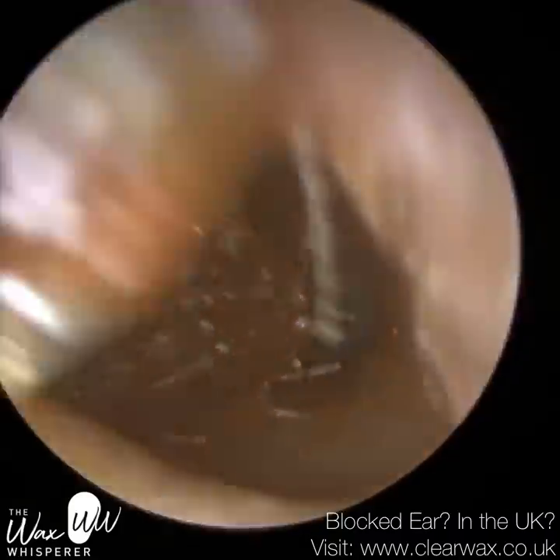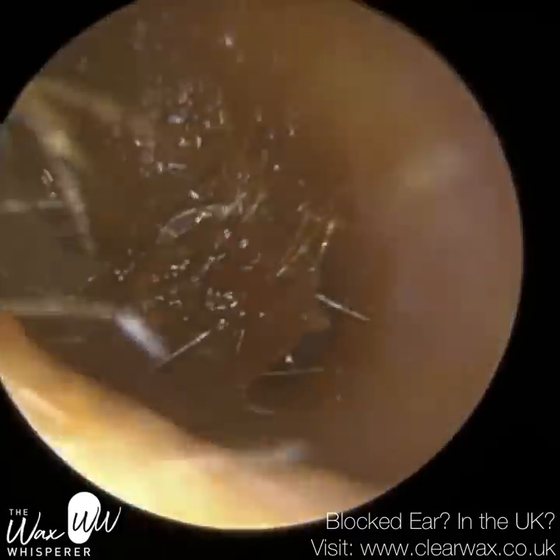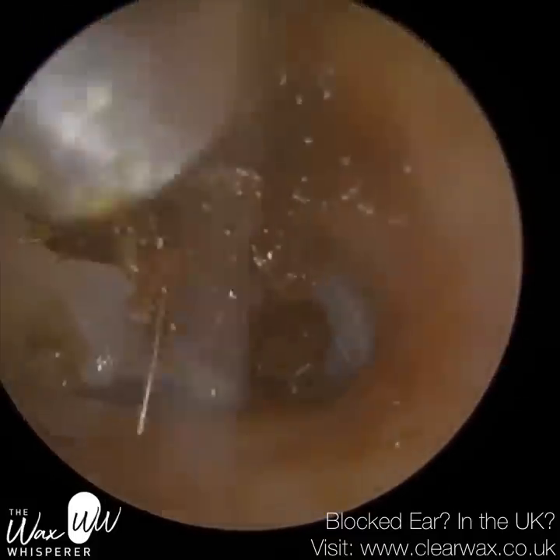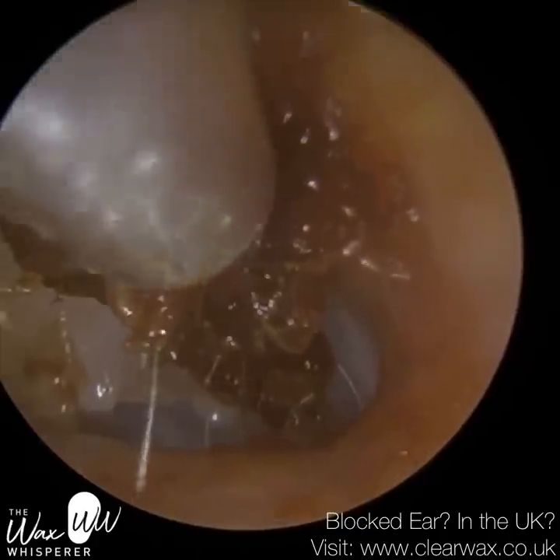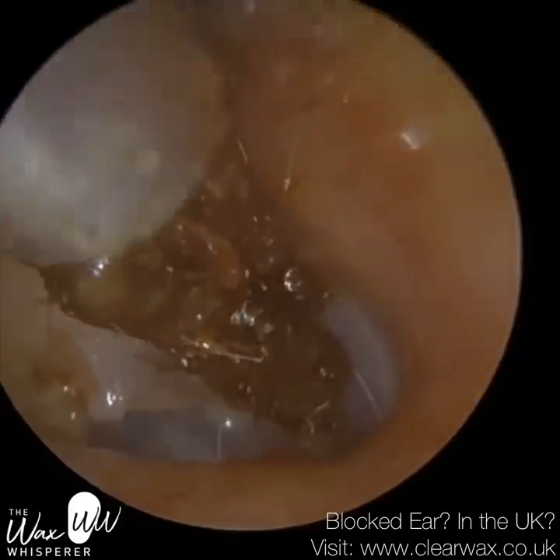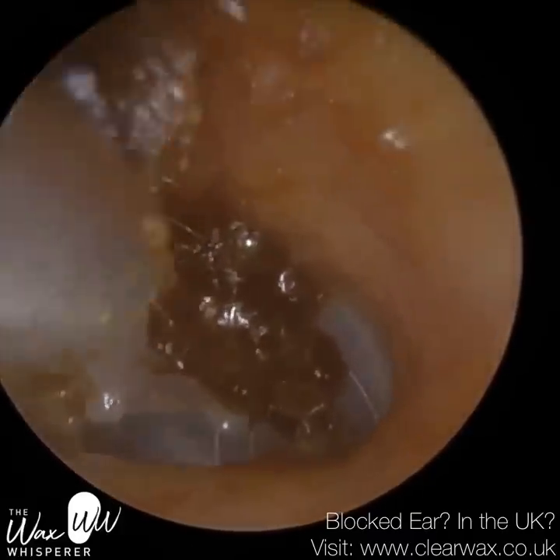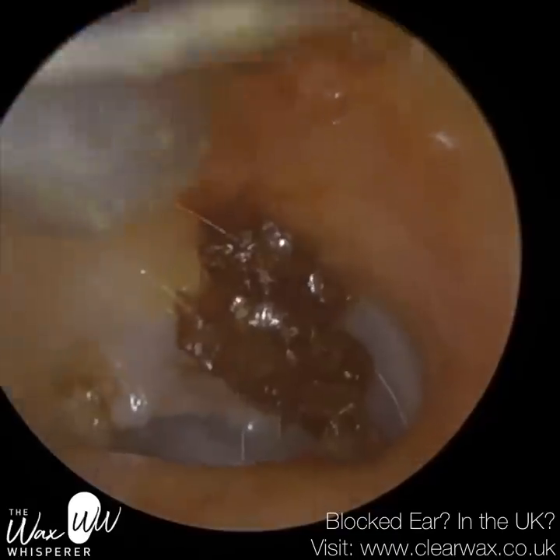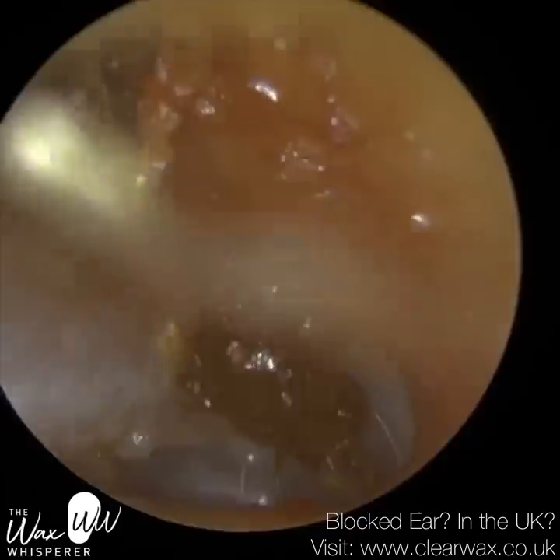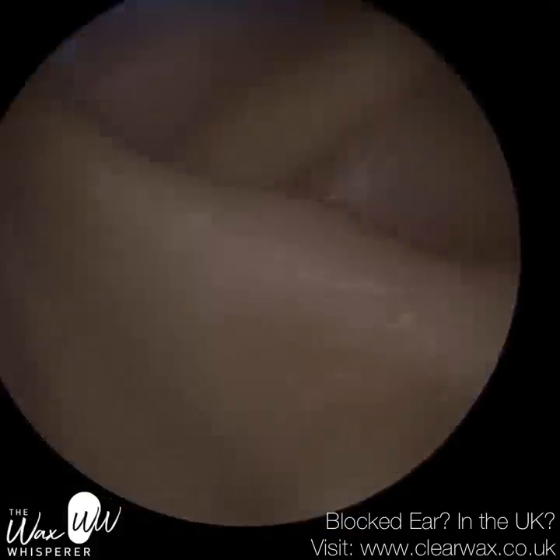It's more efficient for the patient because you don't have to keep them in that position for a long time with the head tilted to one side. You can see the eardrum in the distance — there's some wax up against the eardrum now. This patient returned from holiday recently and went in the pool. The water got into the ear, got blocked and trapped, and the wax they already had absorbed the water, swelled, expanded, and created more of a blockage.